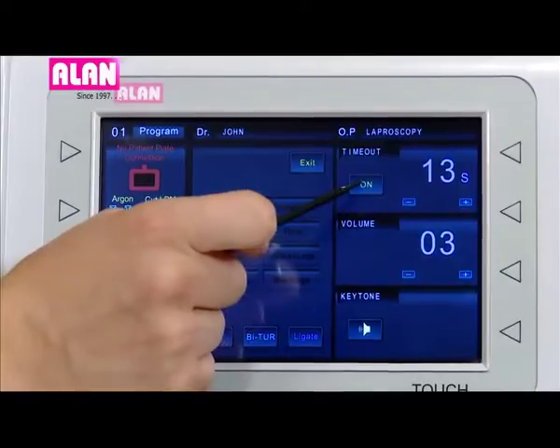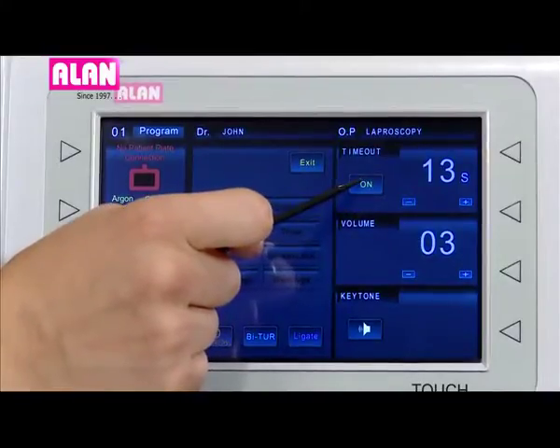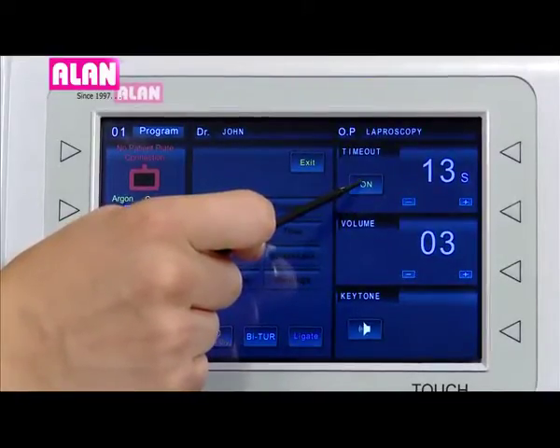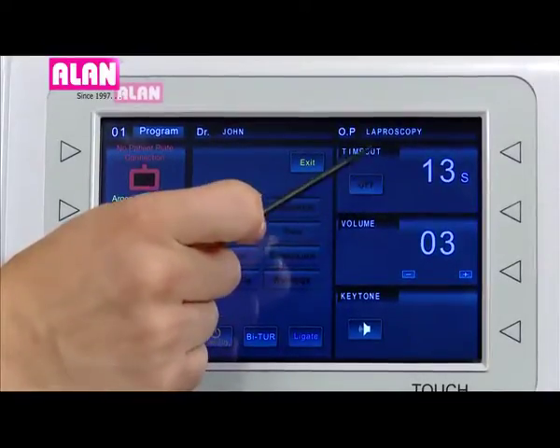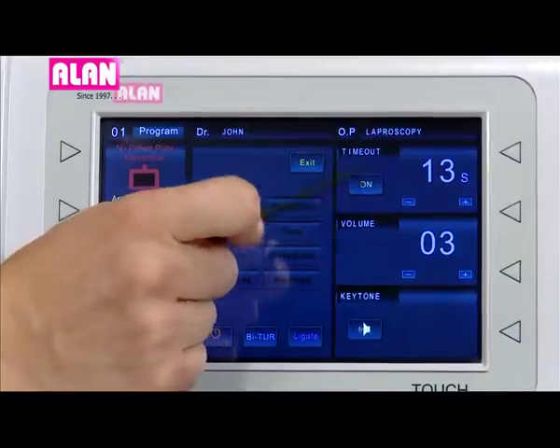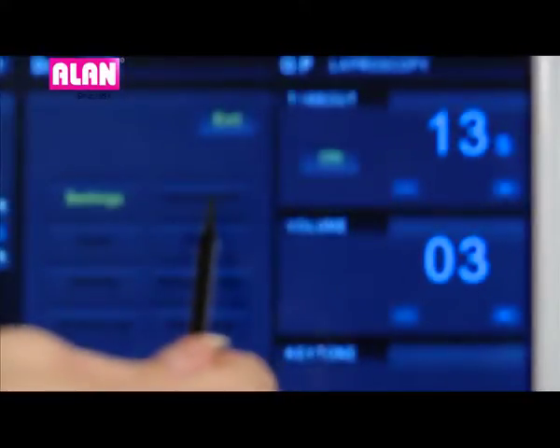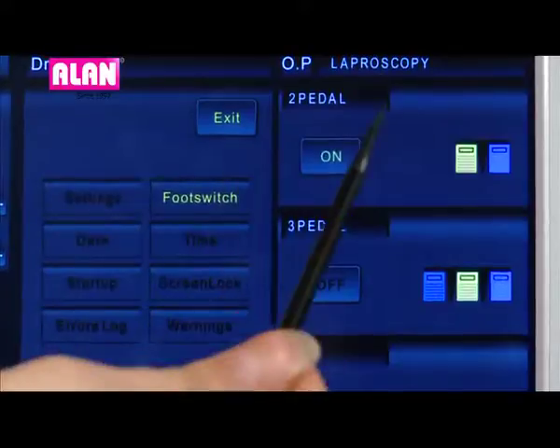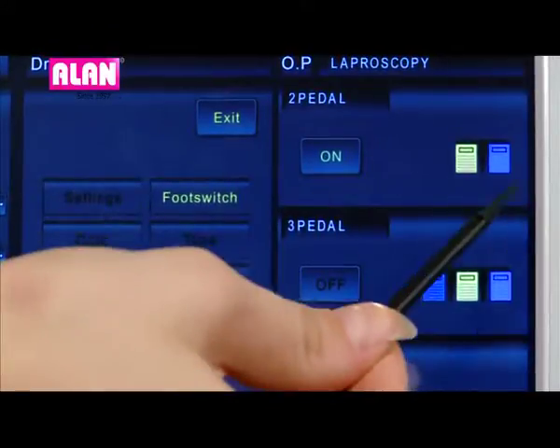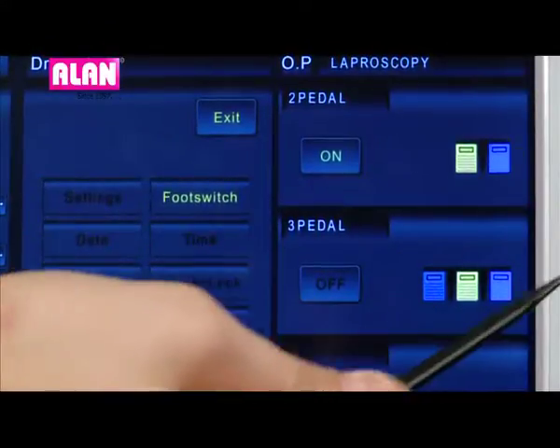The timeout function can be disabled by holding the on/off icon continuously for 5 seconds. In the foot switch menu, we have options for 2-pedal and 3-pedal footswitch.